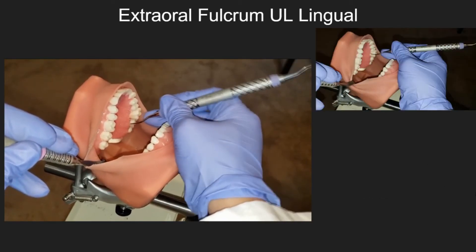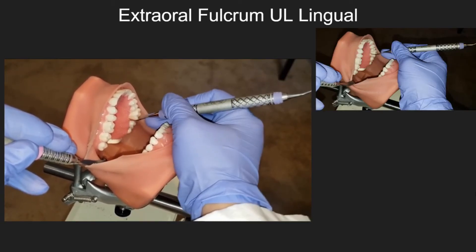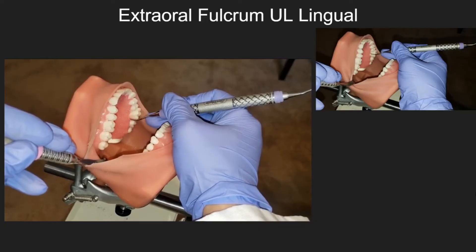Extraoral fulcrum — upper left lingual. In this video, you can see how the clinician is using an extraoral fulcrum by cupping the chin.